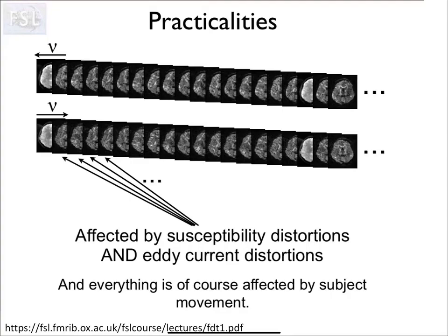Yeah. So which is why, for DTI particularly, there is an advantage to going to higher resolution, right? Some of these issues that you would have with a fat voxel, you can make go away with a smaller voxel. So it's not just the diffusion directions, it's also picking your resolution. And also, the less susceptible your imaging is to these distortions and artifacts, the better.